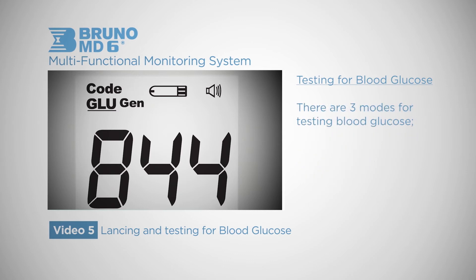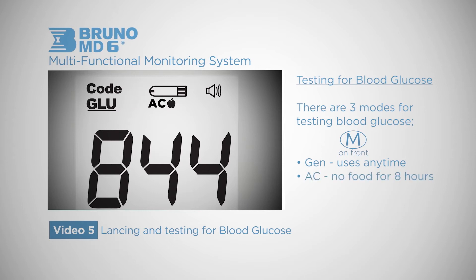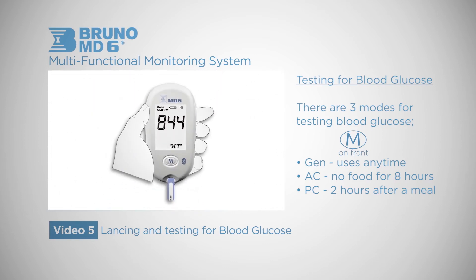The multifunctional monitor offers three different modes for testing blood glucose. You can shuffle through these modes by hitting the M button. Gen can be used any time of the day without regard to time since your last meal. AC should be used if you have had no food intake for at least eight hours — this is a good mode for when you first wake up. PC is for two hours after a meal. We will use the gen mode for demonstration purposes.